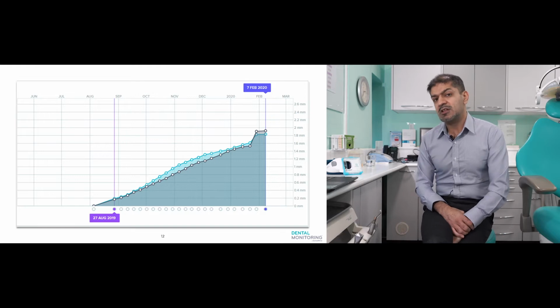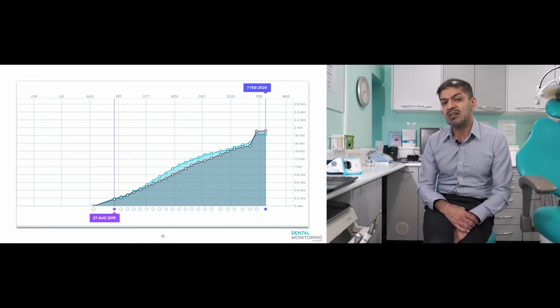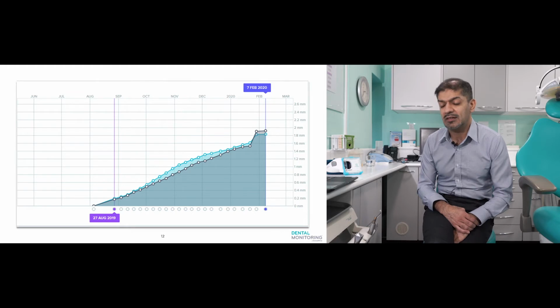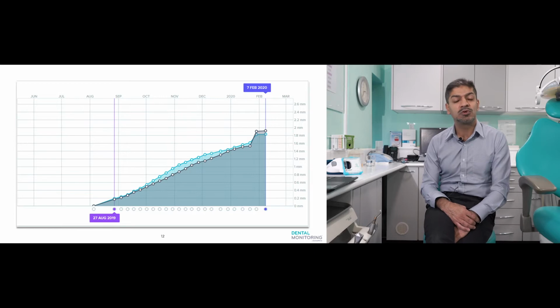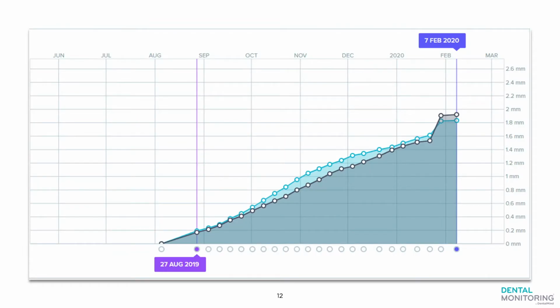Again, if we look at the graphs for this patient, we're able to see the change in movement between each scan, and a very steep and a very active graph suggests that there's lots of movement occurring. And in this period between, say, for example, August or September and maybe December or even January, because there's active movement taking place, there would be no reason to call this patient in for an adjustment. So we would happily leave that patient for at least 3 or 4 months for that graph to become more passive, and aim to see the patient perhaps in February, as it's shown on that screen.